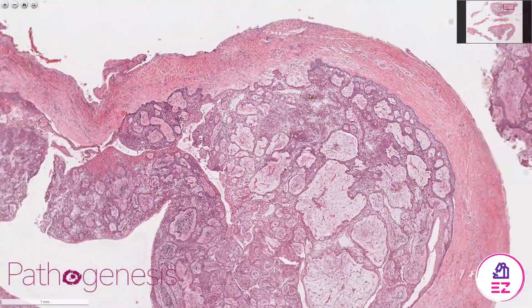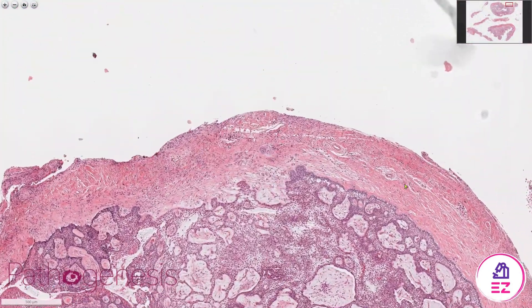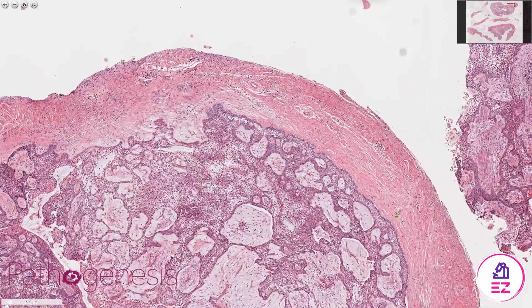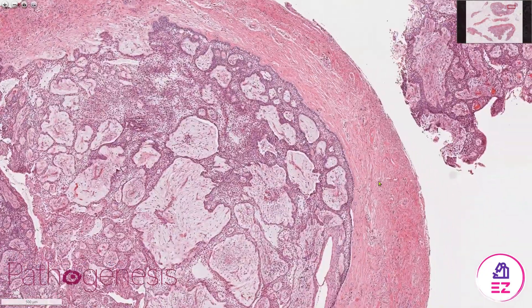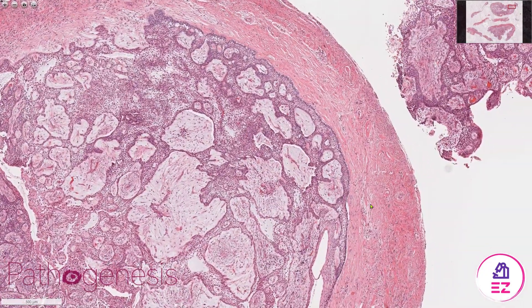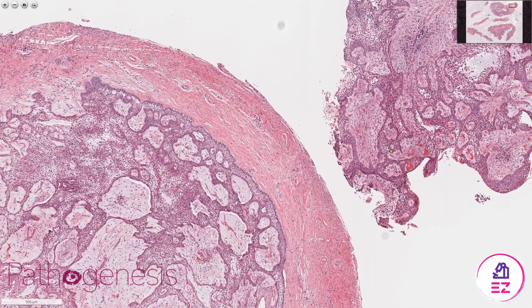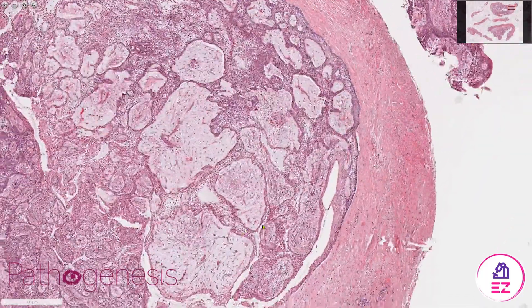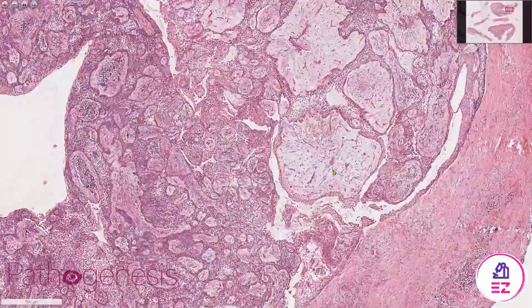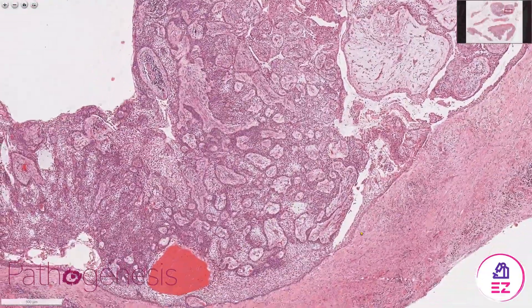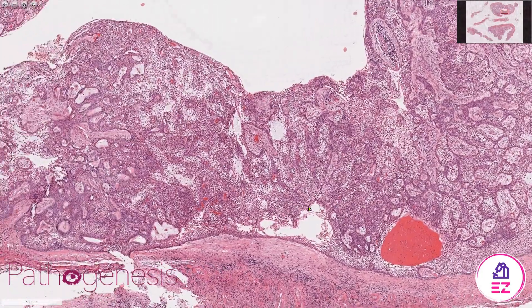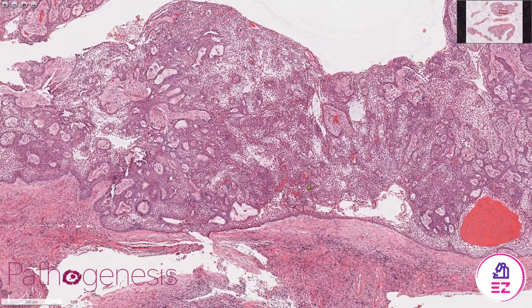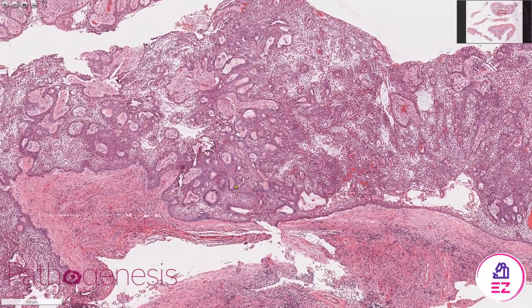As mentioned at the start, there's no proliferation into the surrounding wall, so we don't need to worry about a mural variant. This is just a typical intraluminal unicystic ameloblastoma.